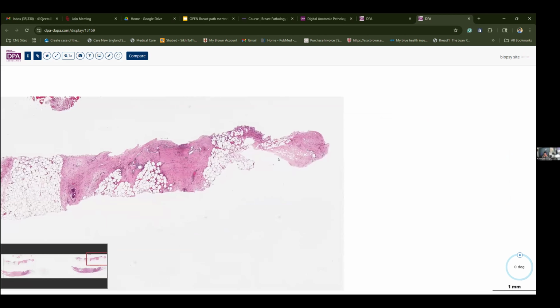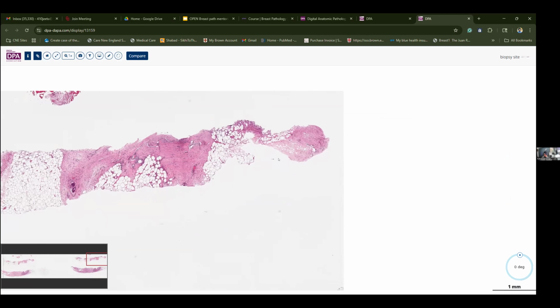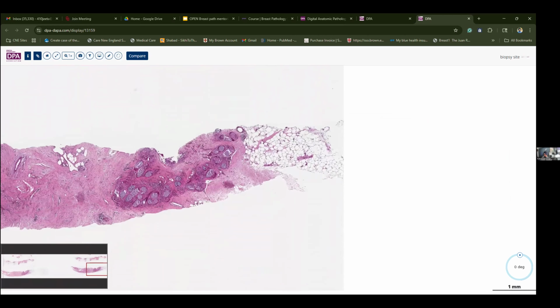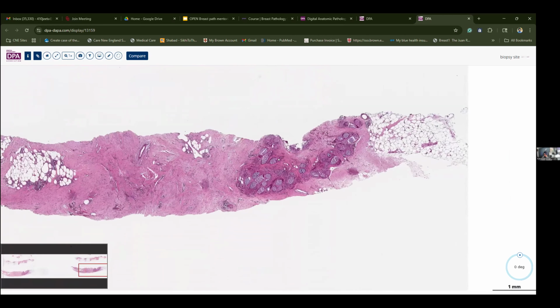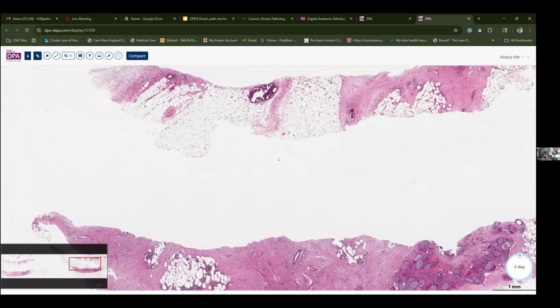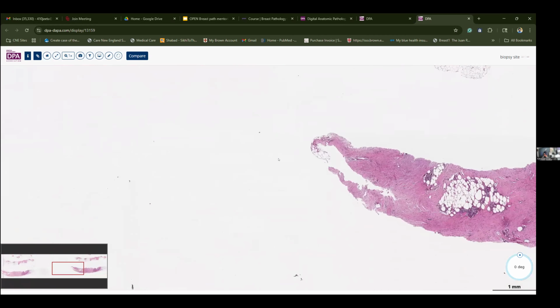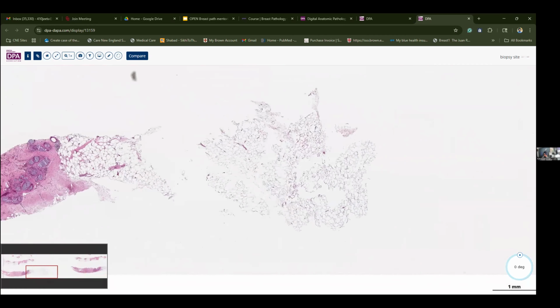like this, as if, you remember the snake game that you played in the Nokia phone, where the snake goes up, down, up, down. So you're gonna go down, look at it, and then move this way, then go up, then go sideways, down, then you go this side.